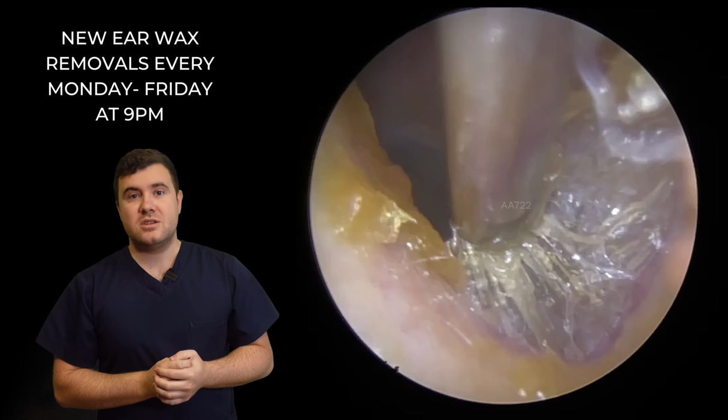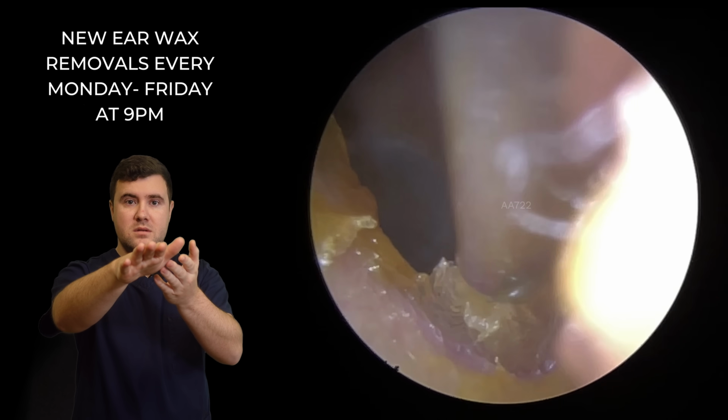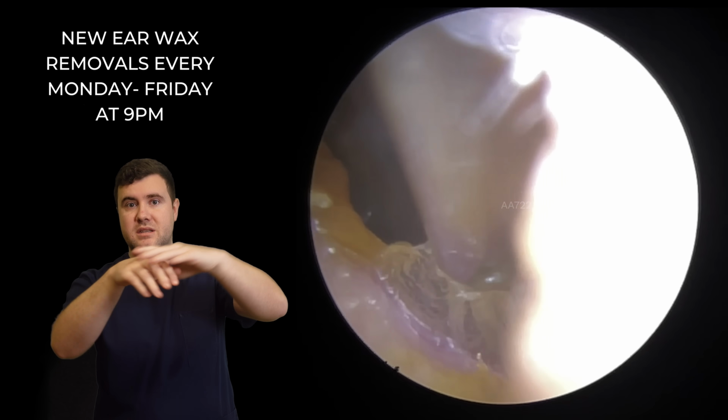Thank you. So as you can see, we've gone back in there to try and tidy this up a little bit, but as soon as we've started to suction that a little bit at the bottom, it has started to peel away this fine layer of dead skin in the ear canal.